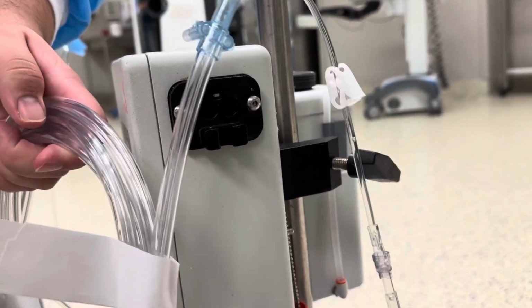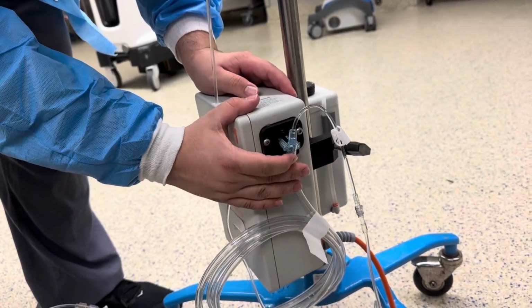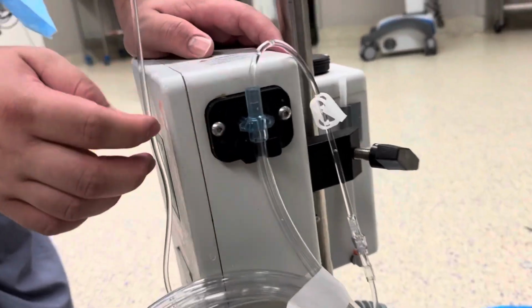You want the coils facing down. You don't want it facing up like this. So have them facing down. And then just stick it in those two holes. Give it a little push and it should be even with that little black thing right there.